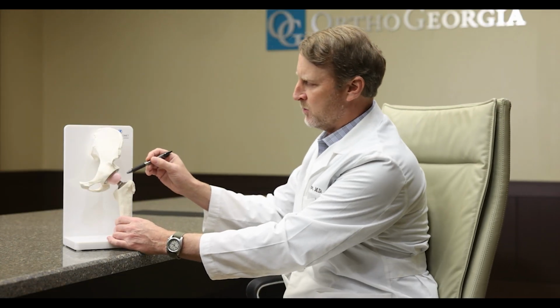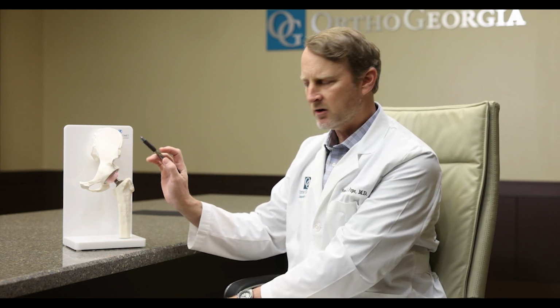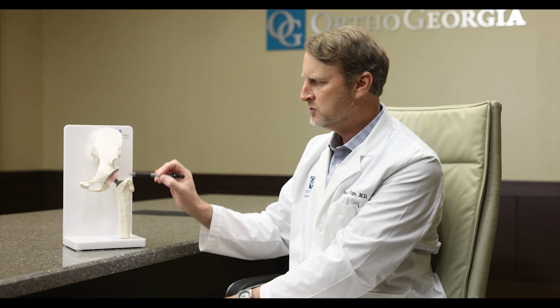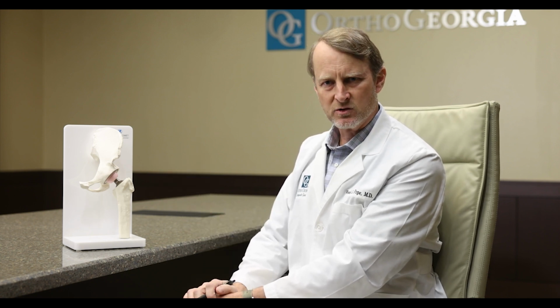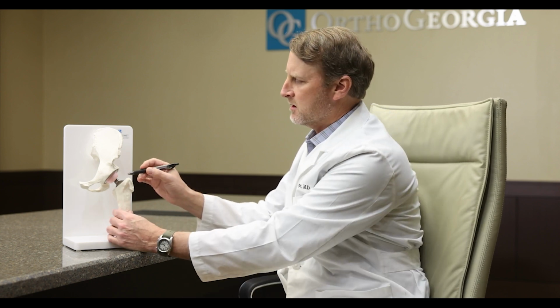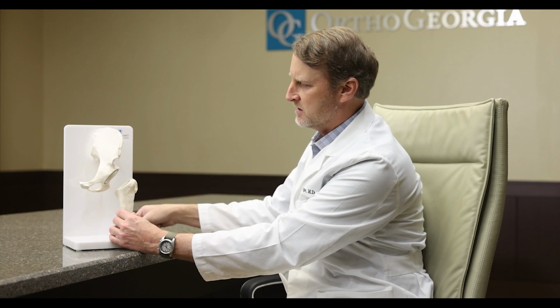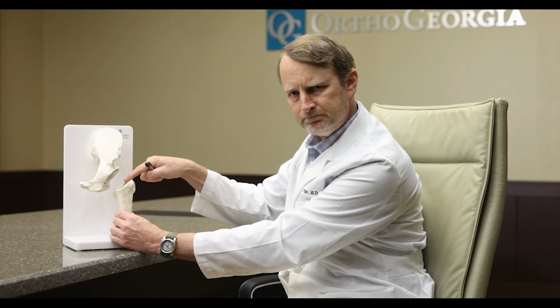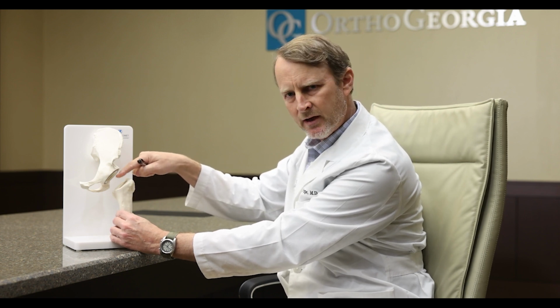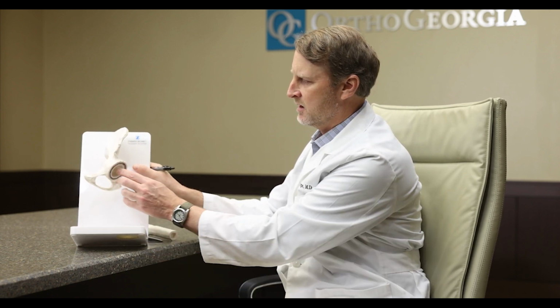This is a modern day hip replacement. We can approach this from several different areas of the body. You can approach it anteriorly, you can approach it laterally, or you can approach it posterior laterally. Your hip surgeon will discuss pros and cons of each of those approaches with you. We will make dissection down to the hip joint, and this gives us access to the hip. A cut is made across the base of the femoral neck, and the diseased part of the femoral head and neck is removed. That then will give us access to the socket within the pelvis.